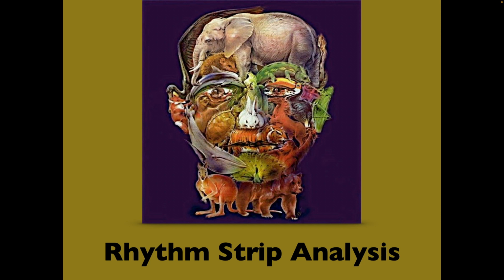Thank you. And then Riley, what is a normal P wave in this class? How do we define a normal P wave? Oh, gosh. This is why we're doing it. Review. Tell me what you remember, if anything. Typically it's prior to the QRS complex.